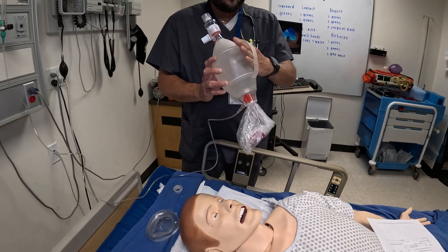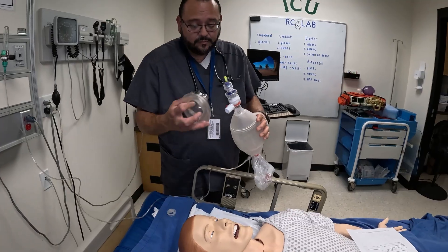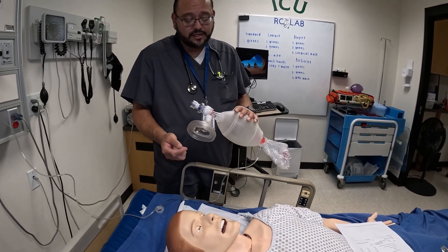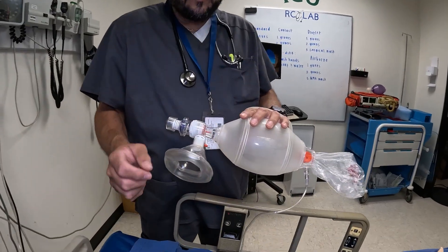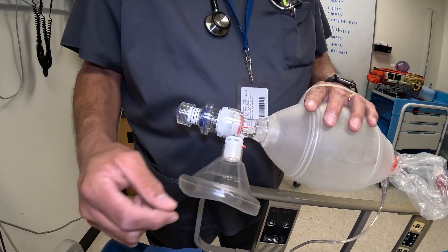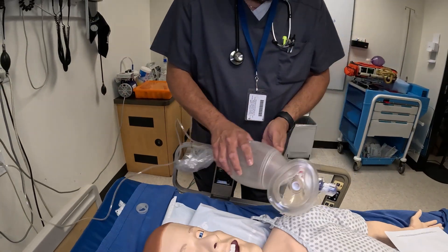Hold the bag like this so you can compress it easily. Make sure you have a good mask and that it's an appropriate size for your patient. Some masks can be inflated — this one does not have it, but some have a little port where you can take a 10 cc syringe and inject air to inflate the mask cushion.